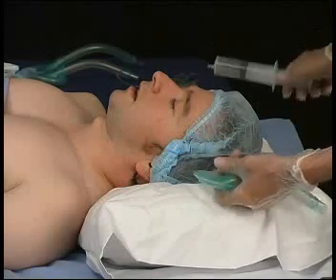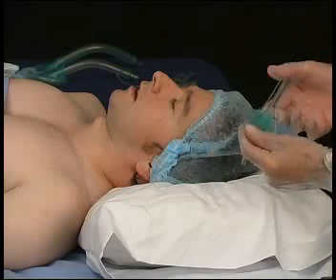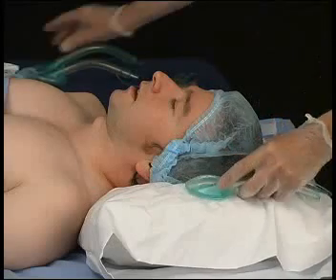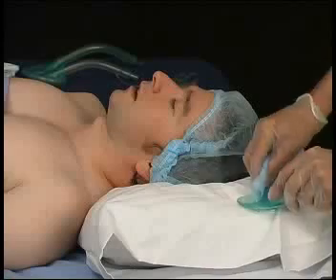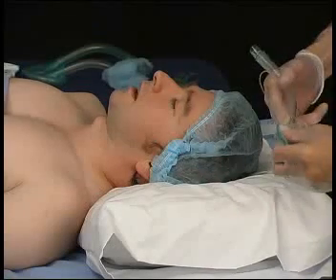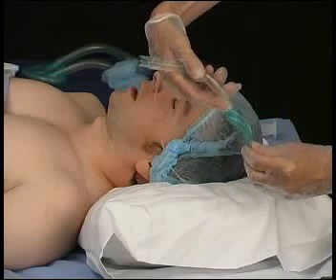This is not so because a filled cuff can collide with the epiglottis. Next, prepare the Solus for insertion by putting some gel or lubricant on the back of the cuff. Just on the tip of the backplate is all that is required. Then, in readiness for the correct insertion technique, insert your index finger into the slot formed behind the flattened cuff and the junction with the airway tube.